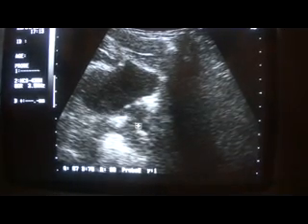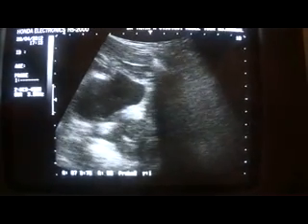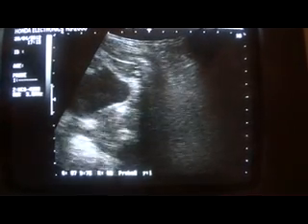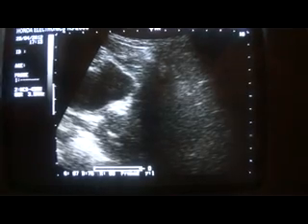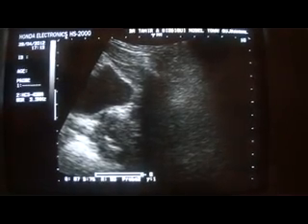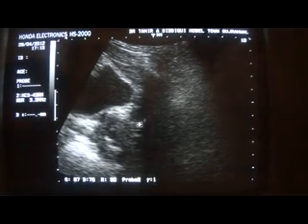This is the longitudinal section and this is the transverse section of the bladder. We have confirmed that the urinary bladder is clear of any calculi or debris, and its walls are thin. The urinary bladder is normal.